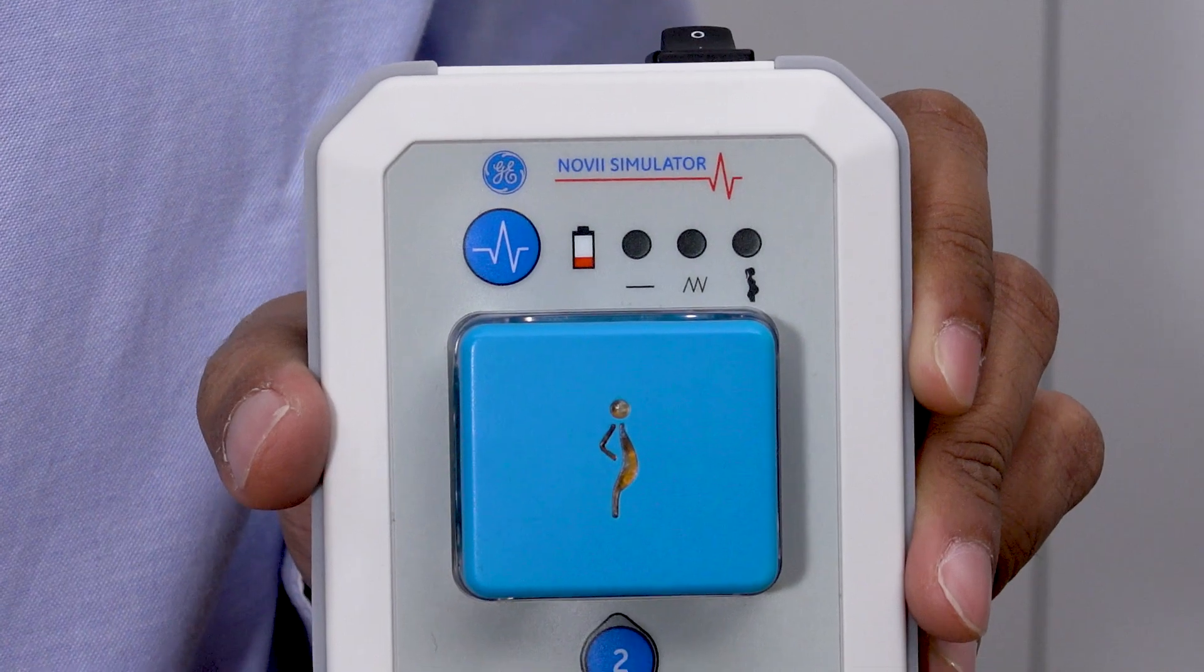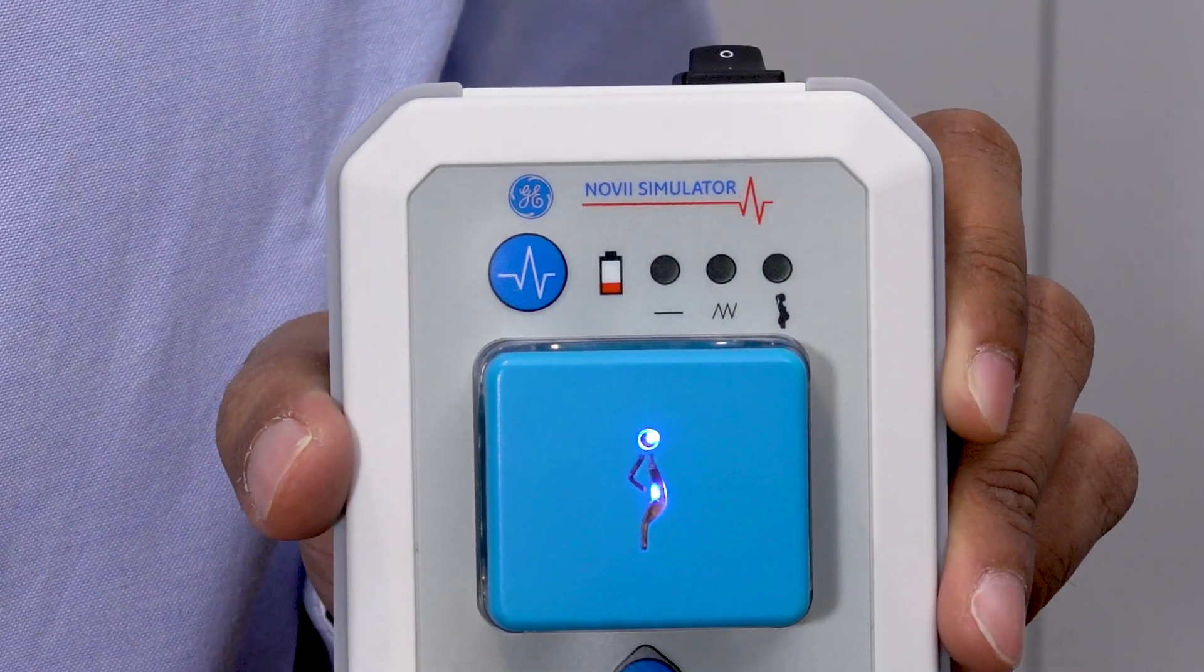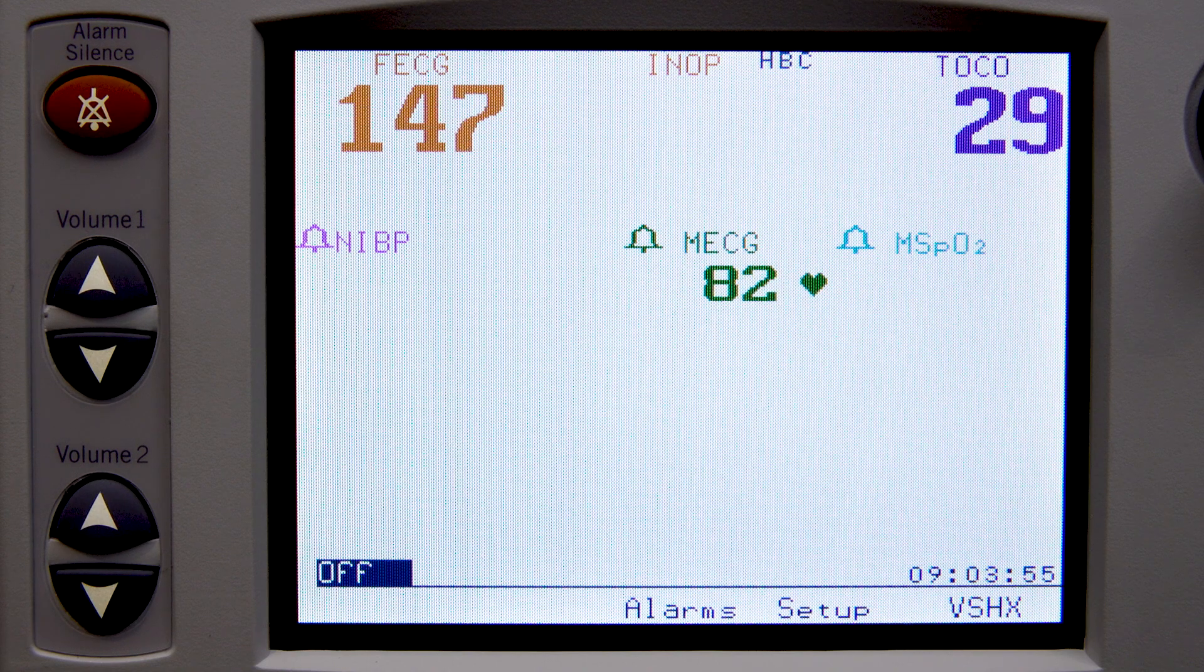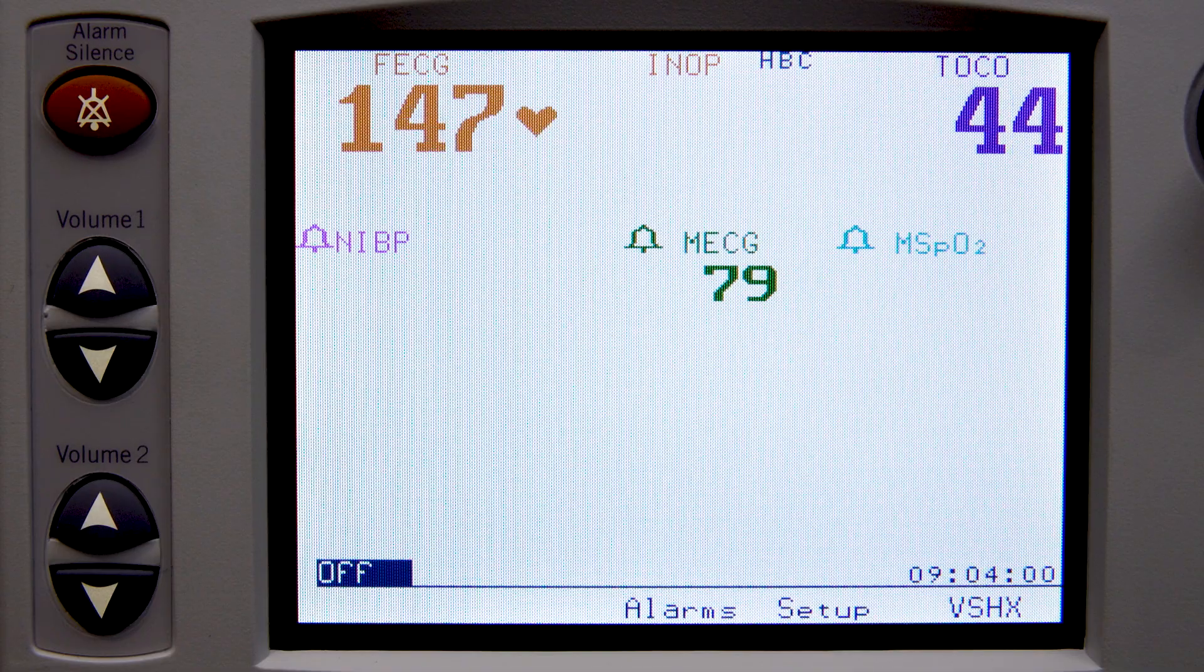And last is demo mode, which simulates maternal heart rate, fetal heart rate, and uterine activity signals as well. But for this mode, in a typical labor scenario pattern, this can be used to demonstrate the Novi wireless patch system.